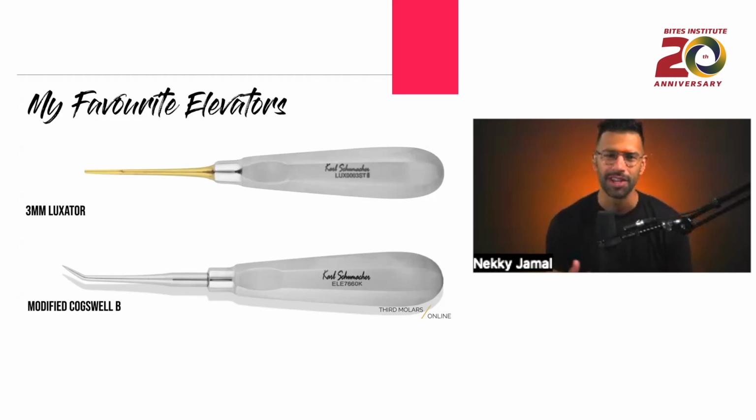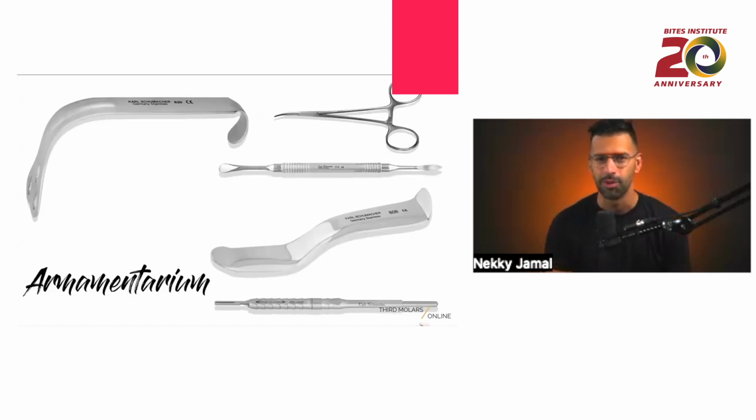My second favorite instrument is a modified Cogswell B, the modified version, not the regular version from Hu-Friedy. Carl Schumacher makes a longer modified Cogswell B. I use these for purchase points. I think it's just a phenomenal instrument. So these are my two instrument recommendations.